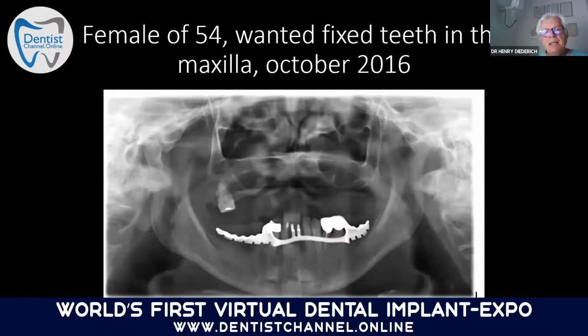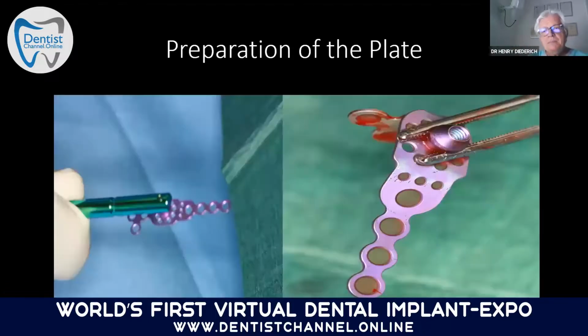Here, another case. This was also a young lady, and you see she was very unhappy about her total prosthesis. There was no retention. And then the colleagues, of course, offered sinus lifts, they offered bone grafting, which took a lot of time, and general anesthesia, and the patient did not like that. So what may be our treatment plan? Remember, you see the plates. We are adapting our plate.